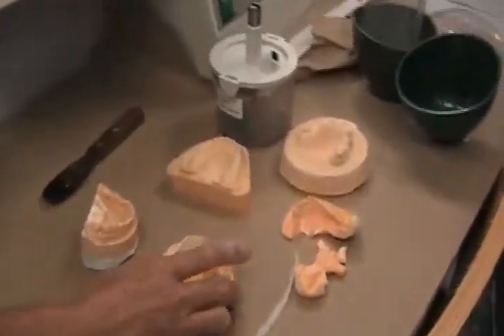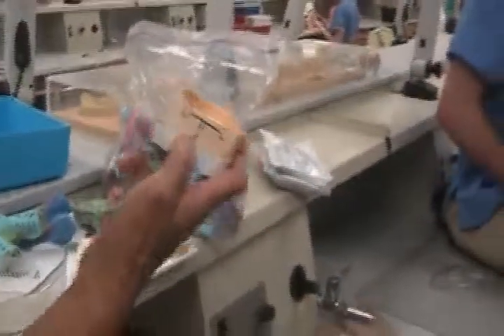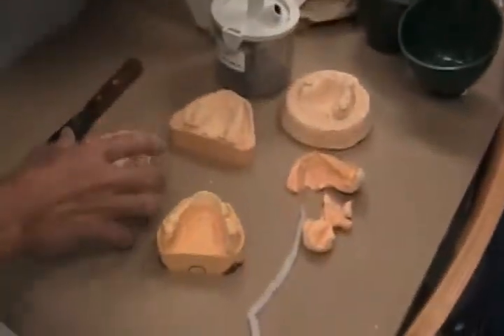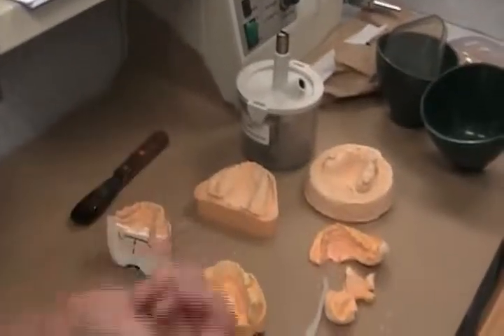Crown and Bridge stone is more dense, more fine. It's more accurate. This will do for your alginate and study casts. The reason is the compressive strength of this stone is just the right amount so during processing the lab can do whatever they want.